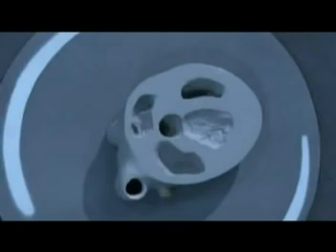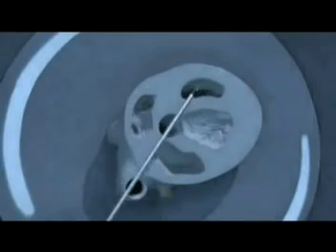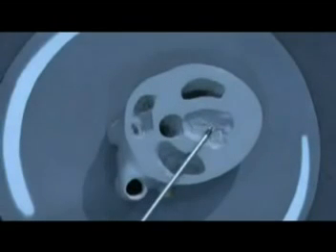In this view, there are effectively five chambers, which is why it sometimes gets called the five-chamber view. You see the right ventricle, the left ventricle, the right atrium, the left atrium, and the aorta.